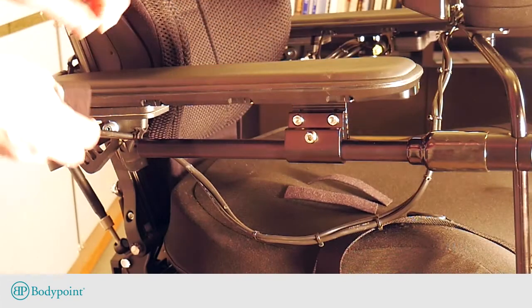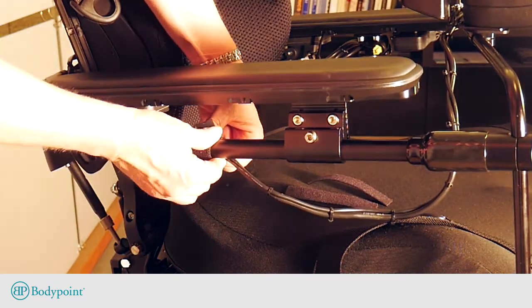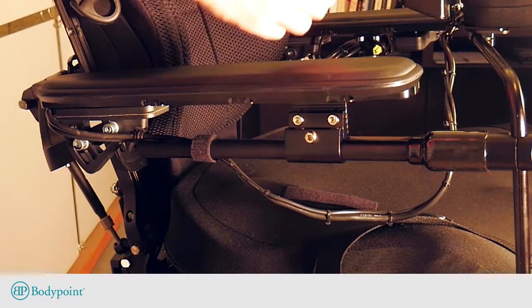We suggest filing the end smooth and covering it with the included plastic cap. Finally, use the included Velcro straps to secure the wires while allowing enough length to flip the joystick out of the way.